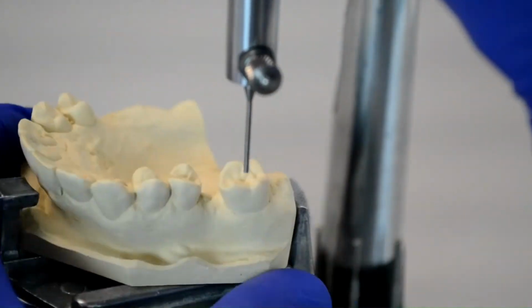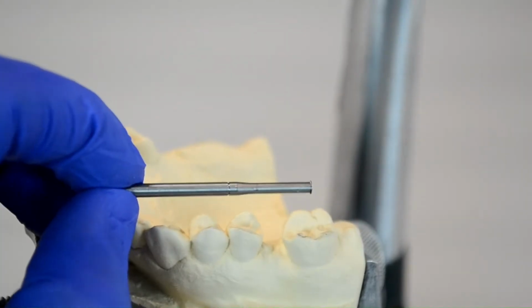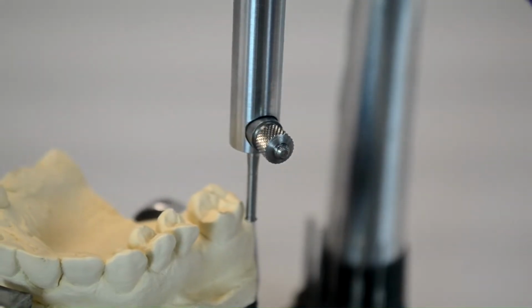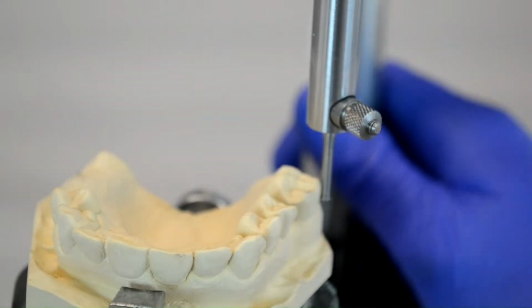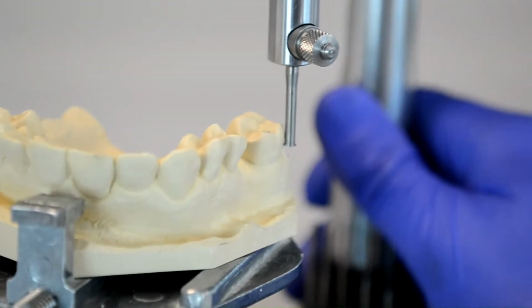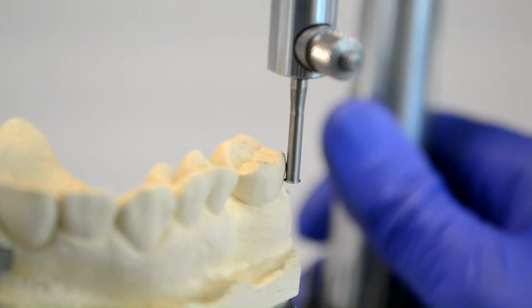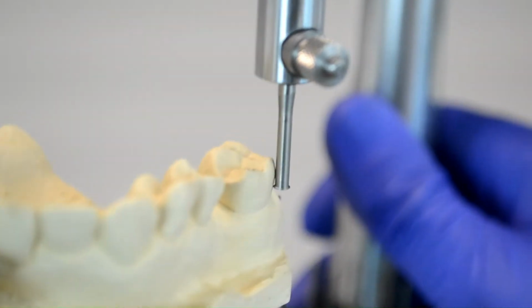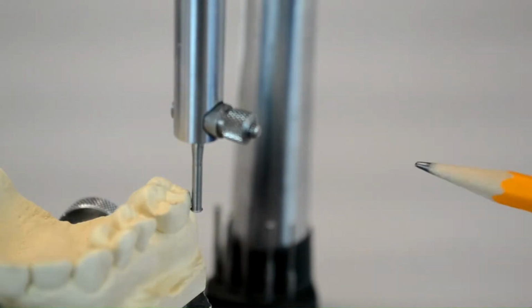Once we are satisfied with the path of draw, it's time to switch out the analyzing rod for the 0.01 inch undercut gauge. We will now attempt to find those undercuts that we decided we needed in our initial plan. In order to identify the location of an undercut, the undercut gauge needs to contact the tooth at the shank and the disc. The undercut is located at the point of contact of the disc with the tooth surface.